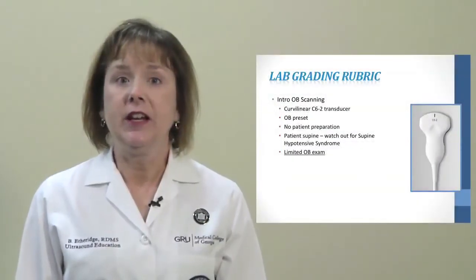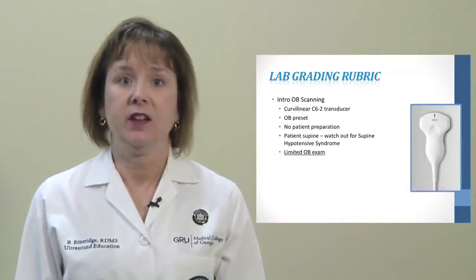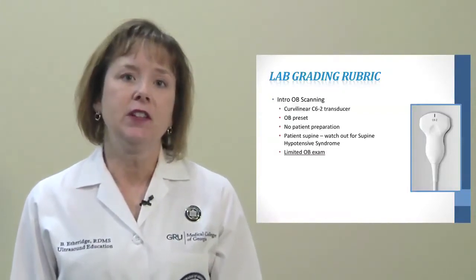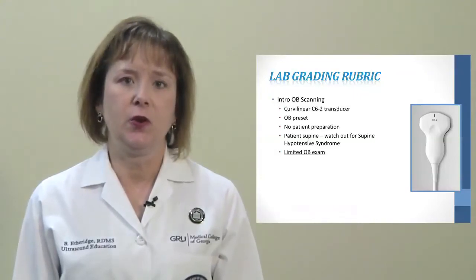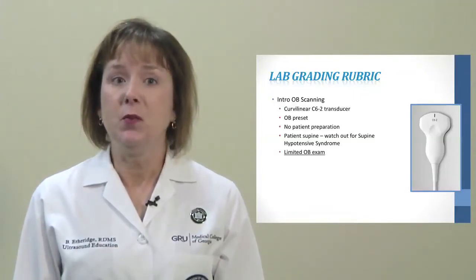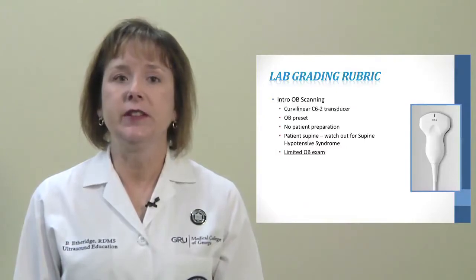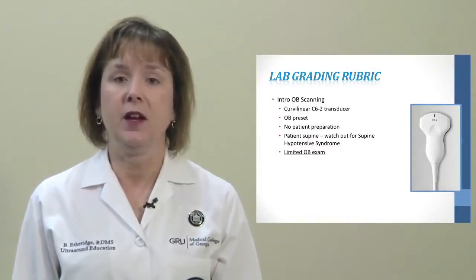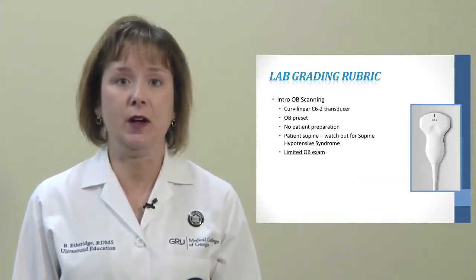Next, we will be looking at some introductory aspects of second and third trimester OB scanning. The curvilinear C6-2 transducer and the OB preset will be used for this exam. There is no patient preparation for this exam, and your patient will usually be supine.